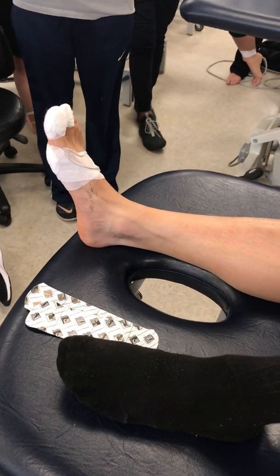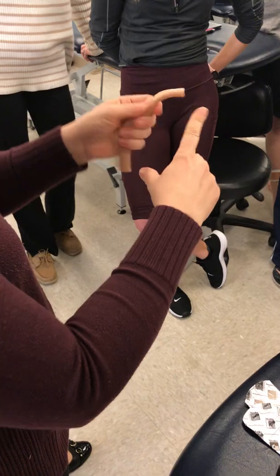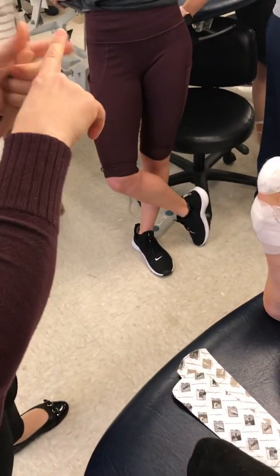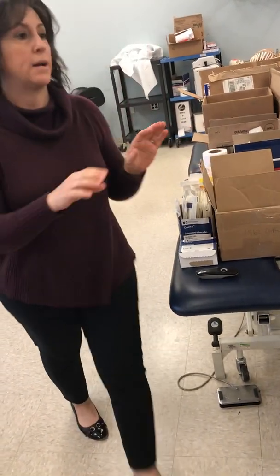And then when we get to fingers, you'll see we use the smaller ones for fingers, but also for jammed knuckles. What I'll do is I'll cut these, and I'll put this through the jammed knuckle. So as you're returning to sport, this is another way to protect joints and things, okay? So I like that. And then let me just show you this. You'll practice all this stuff through the week and next week, but I wanted to get this on tape for some of you who will be in here.